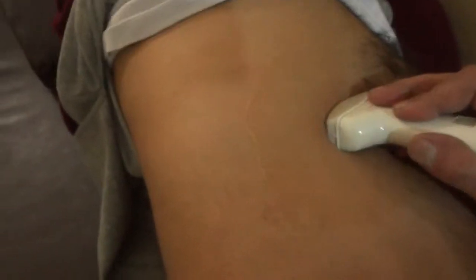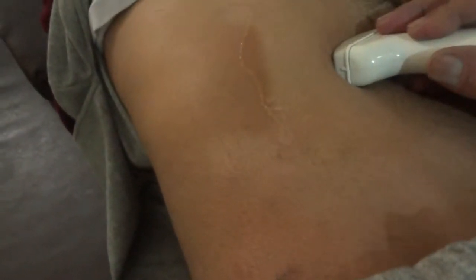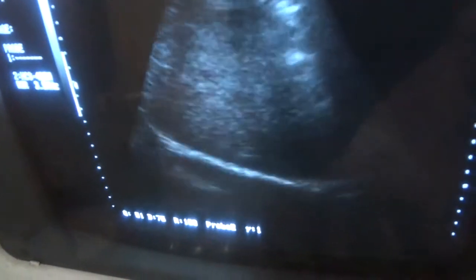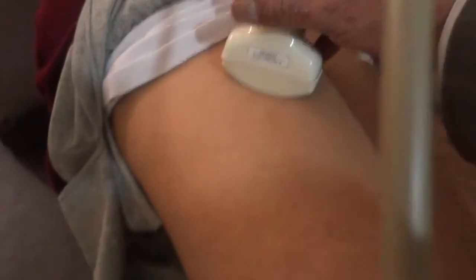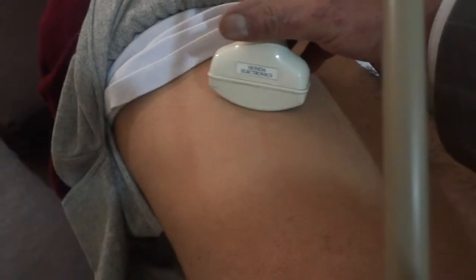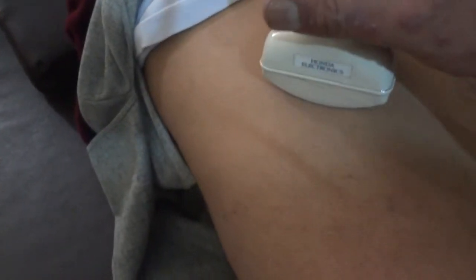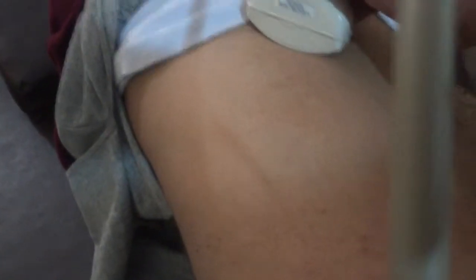Now in this direction, again the patient will take a deep breath and hold it. If I place the probe here, tilt it, and press the probe in the intercostal space with the patient in left lateral decubitus posture, I may have to angle the probe in various directions — up or down — depending on the patient.